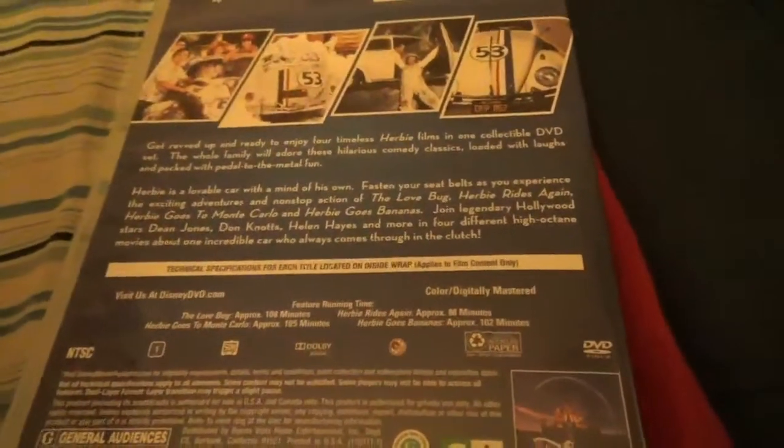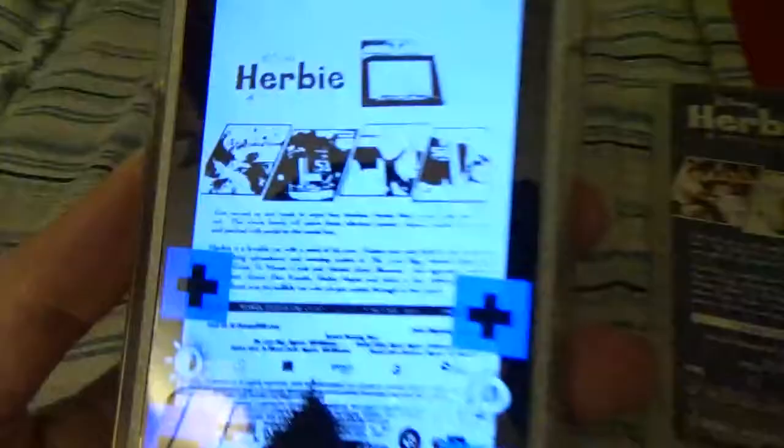But once or twice I have had it completely freeze up. So let's go ahead and pause display. Okay, so display's now paused. Now you notice that the image is over here. What we're magnifying, I'm sorry, what we want to look at is over here, and yet the magnified image is over here. So we can increase zoom.